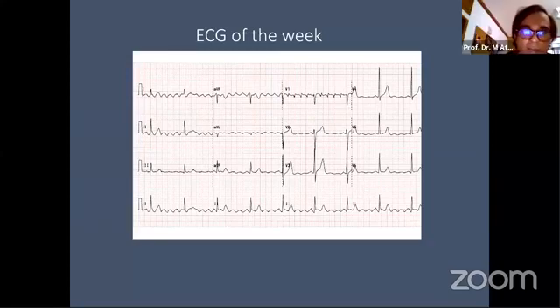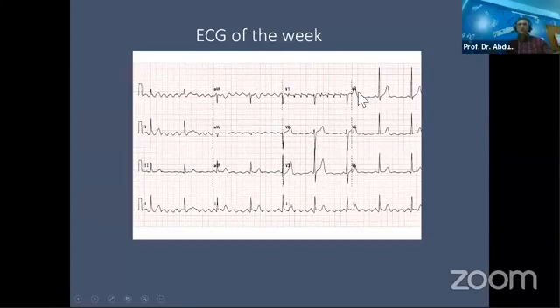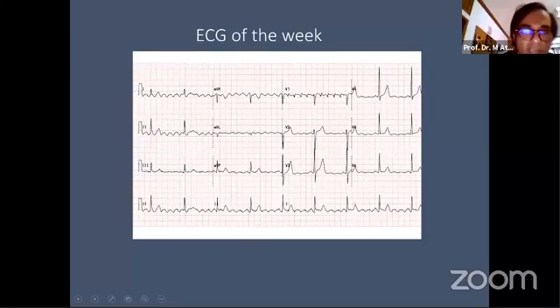So unilateral Parkinsonism. We do not expect this much tremor, but the tremor is more on the right hand. Tremor is more on the right side. So no one needs to say Parkinsonism, but this is not flutter. This is the basic sinus rhythm with artifact, that is the tremor.